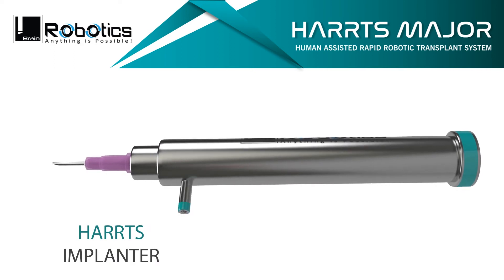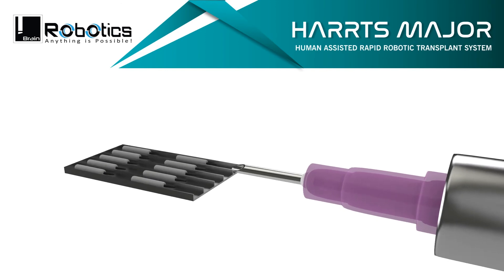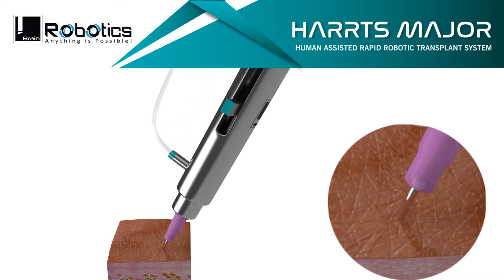The HARRTS implanter is the world's best robotic implanter, which self-engages the grafts by mild and safe suction, and is capable of implanting without the need of creating slits in the recipient area, though it can be used with slits as well.